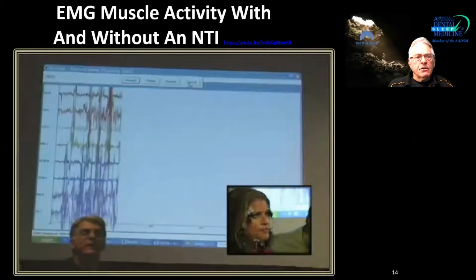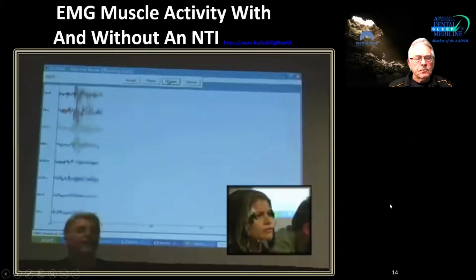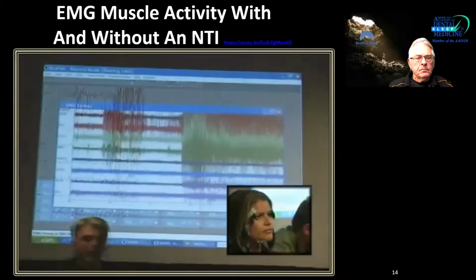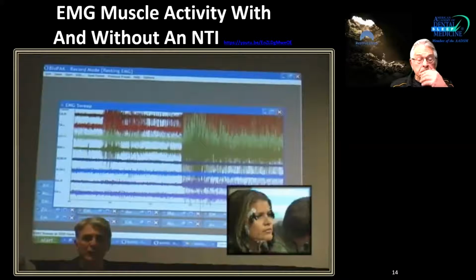So this is Dr. Glassman, and we're gonna begin to start to look at anterior midpoint stops. So let's watch this moment here. And a little bit more, and a little bit more, and a little bit more, and squeeze. Started to go, then backed off a little bit, and that's so with those teeth together, we don't start getting anything until we reach a very specific threshold, and they take off.